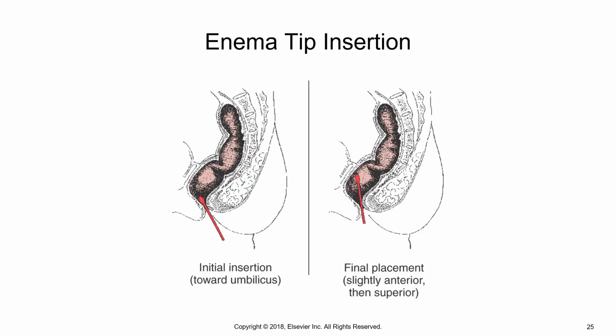You're telling them, okay, we're going to go ahead and insert the enema tip. I just need you to breathe slowly in and out your mouth. Or sometimes I tell them breathe in your nose, out your mouth, and then you slide the tip in, and you do go up and towards the umbilicus, but basically the tubing kind of guides itself.